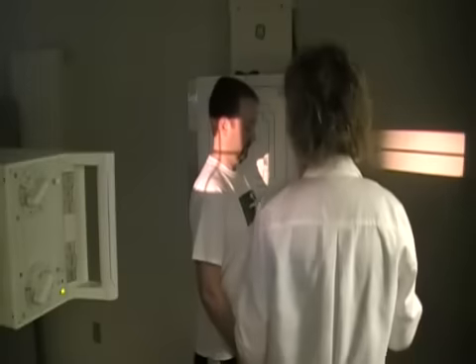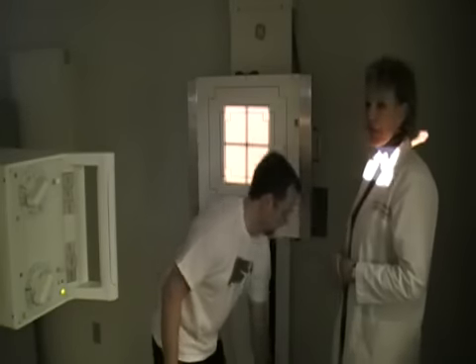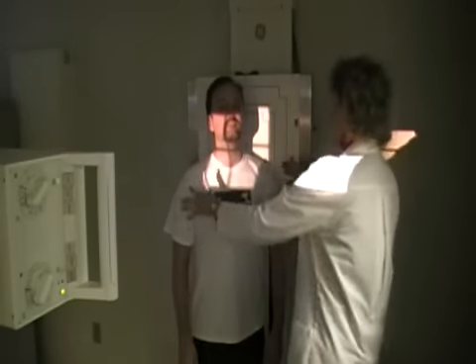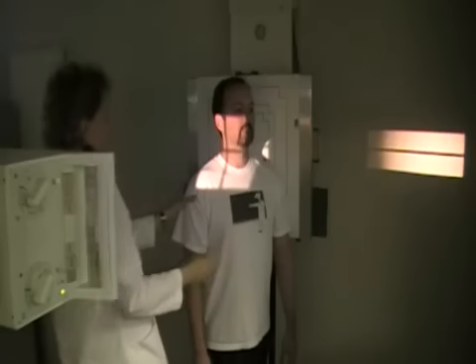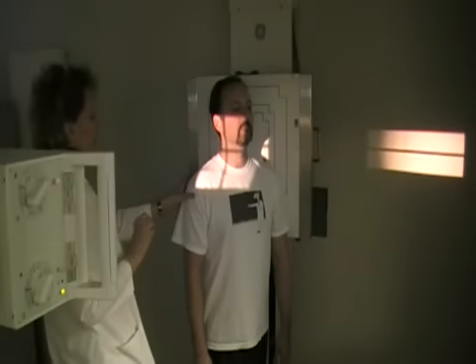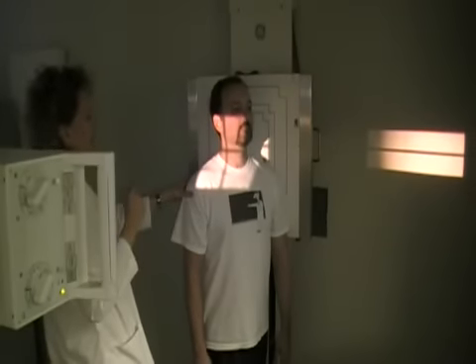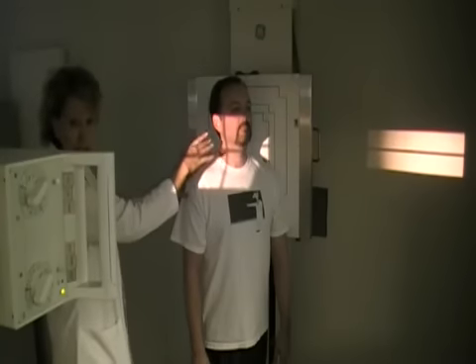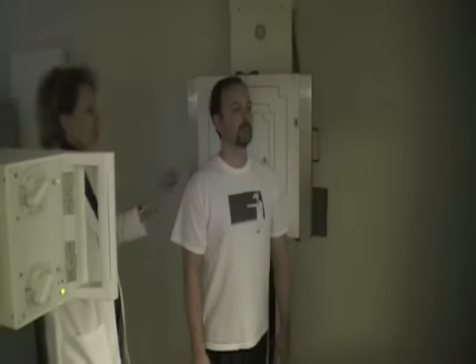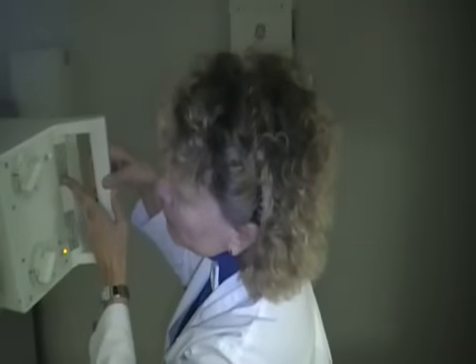Next I'm going to do the oblique cervical spine, the AP oblique. We're going to do the left, and you're going to turn your patient about 45 degrees from where he had the left shoulder up against the board. Now you want to check your crosshairs again. One change you do want to make is on the AP obliques, you want to use the 15-degree cephalic angle. So I'm going to go ahead and put a 15-degree cephalic angle, and actually you do have a range of 15 to 20 degrees.